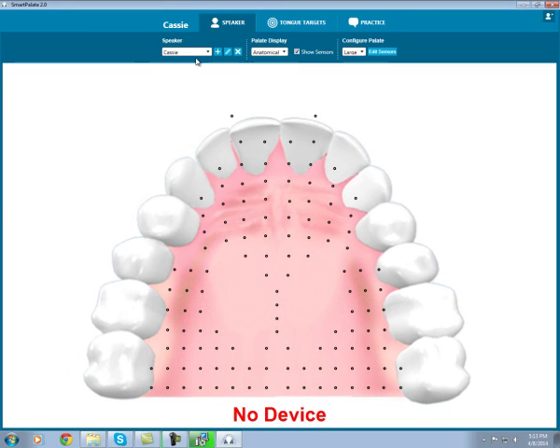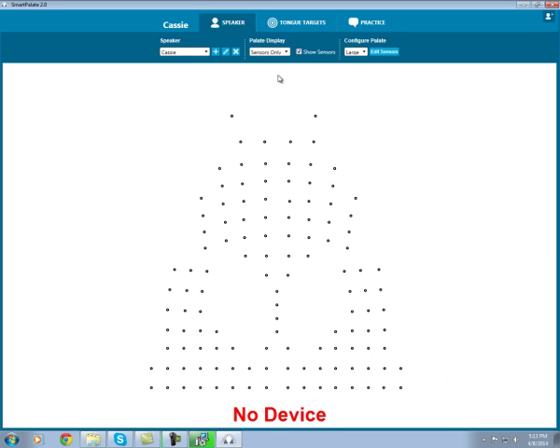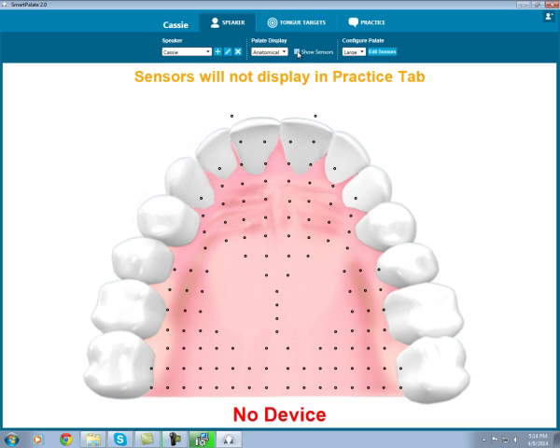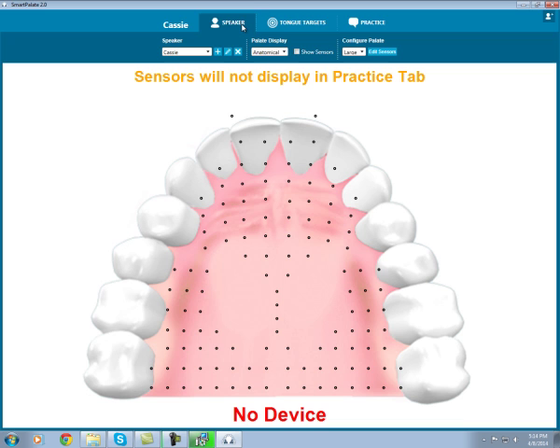You can customize the palette display by selecting the anatomical view, standard palette, or no palette display at all. I'll keep the display on anatomical. Here you can decide if you would like the black sensor dots to display when you are in the practice tab. If I uncheck this box, instead of seeing the black sensor dots like you do now in this view, it would look like this. For the purposes of this demo, I will keep the sensor dots displayed.